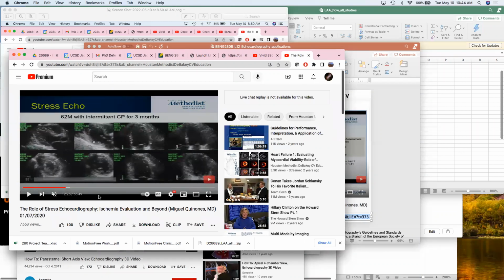As opposed to going down and classically drawing borders, calculating radial thickening, all these numbers, which are susceptible to huge errors, right? But when you look at it, it's fairly obvious what's going on. So that's what deep learning is actually good at, right? Just like figuring out if it's a cat or a dog, right? And so it's the same problem.